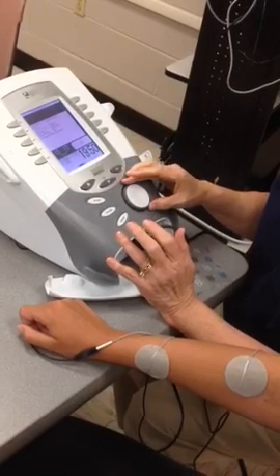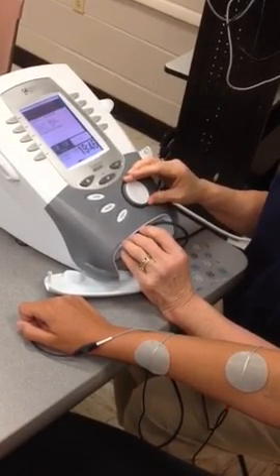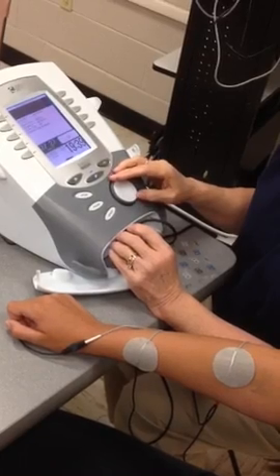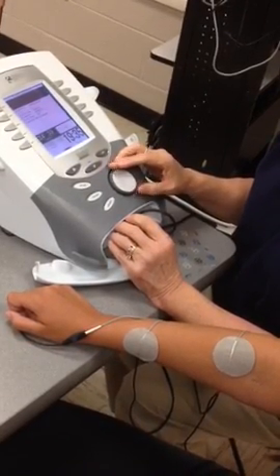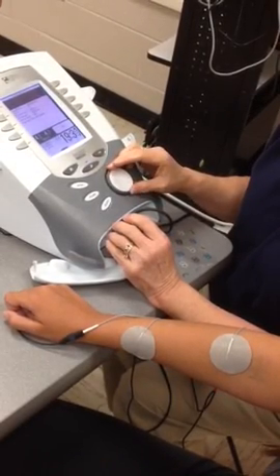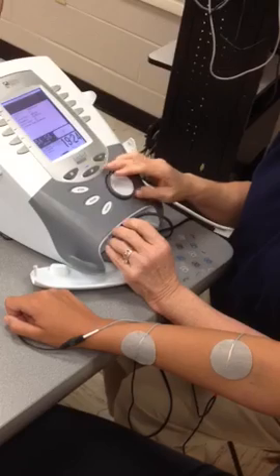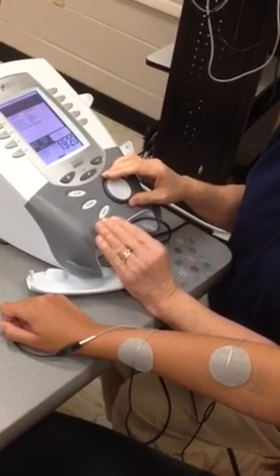Very little. All right. So we're going to turn it up till you feel some tingling. Just let me know when. Yeah. Okay. So just turn it up slowly, watch their face, listen for any vocalizations. Okay. All right, so that's when you're just beginning to feel it.